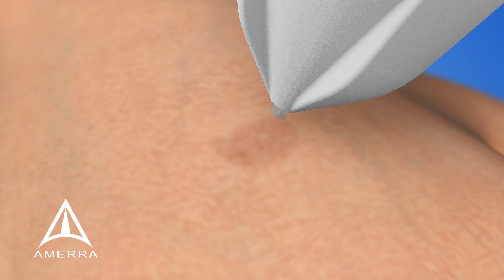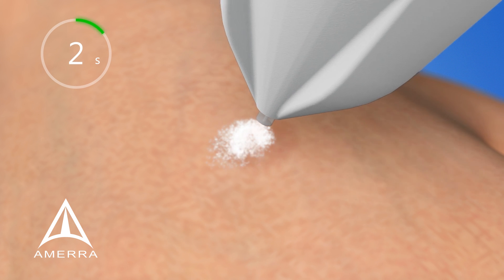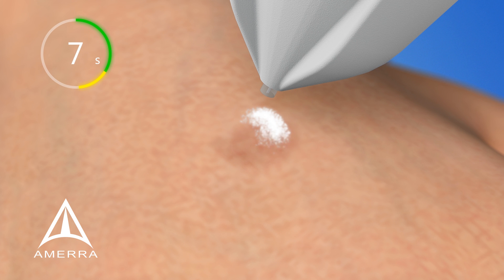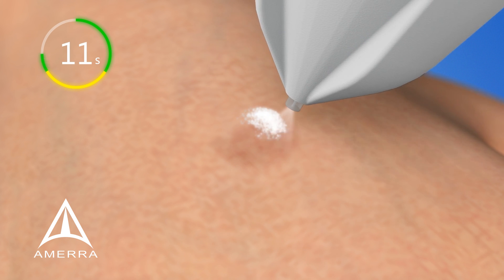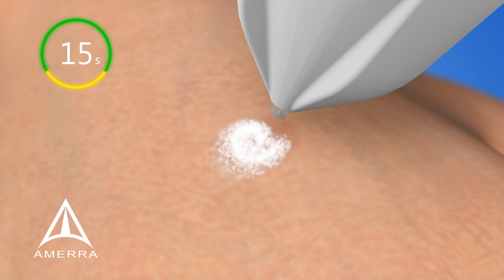When treating larger or heavily pigmented age and sunspots, we recommend starting in the middle of the lesion, spraying CryoClear in small concentric circles, moving the spray to the outer edge of the treatment site. Wait 5 seconds, then begin the next 5-second treatment on the outer edge, working your way back to the middle of the lesion.